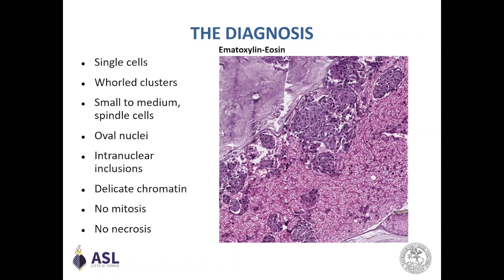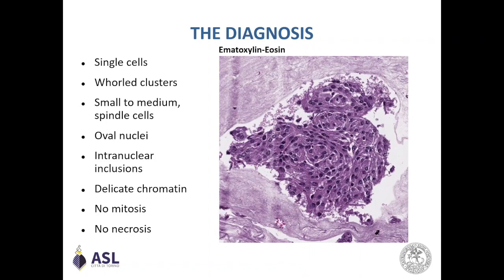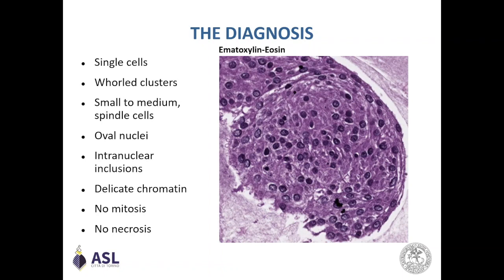Back at the lab, the formalin-fixed material was paraffin-embedded to obtain a cell block. From this cell block, hematoxylin and eosin stained slides were cut. You can better appreciate the architecture of the lesion, composed of monomorphous spindle cells arranged in groups and in whorled configurations. The cells were monomorphous with bland oval nuclei and delicate chromatin. No mitosis and no necrosis were found.